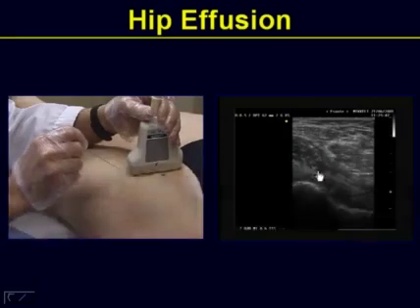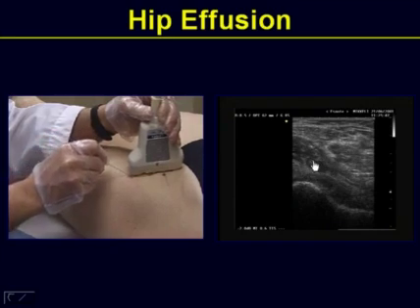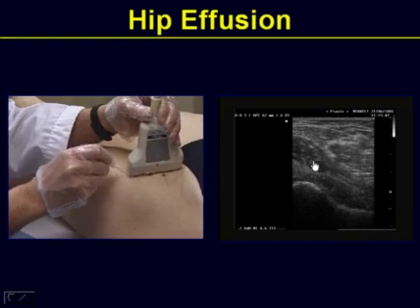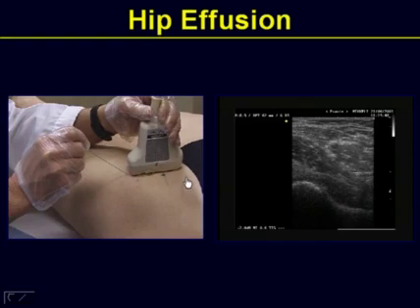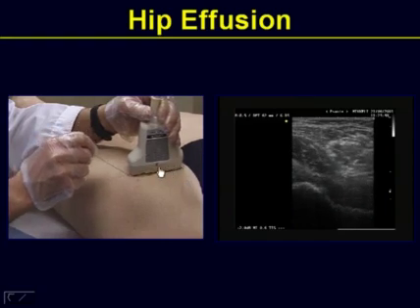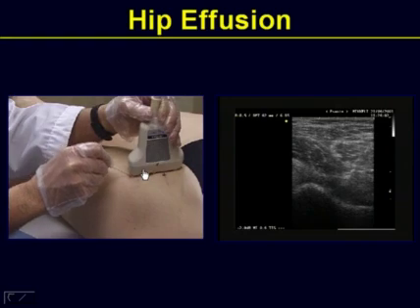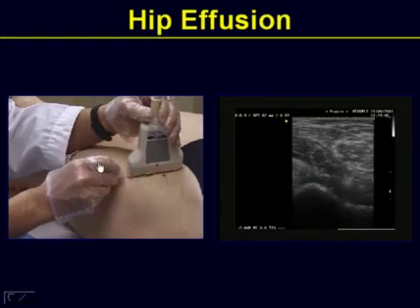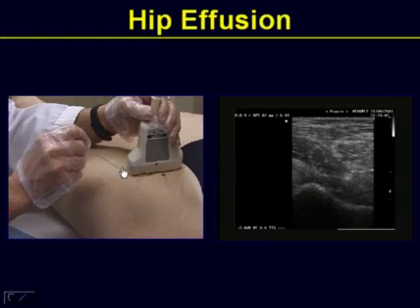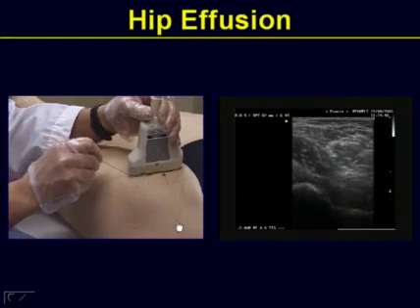This is a video clip available on the EULAR website, and this is Dr. Johan Koski from Finland, and this is the approach that most of us will take. Note that he will park the probe more or less in a compromised long axis, short axis view to get a longer runway of the femoral neck, and that he likes to visualize the shaft of the needle in the long axis view, which is the same way we practice in our institution.